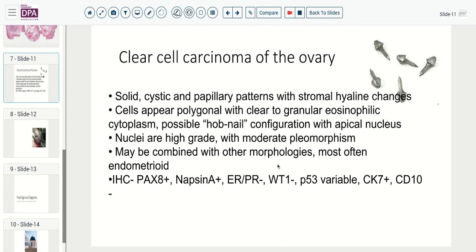Immunohistochemically, these are Pax8-positive cells, and very helpfully, they are Napsin-A-positive. No other ovarian tumors mark with this Napsin-A marker. Usually they are hormone receptor negative, WT1 receptor negative, and P53 expression can be variable — most are not mutated, but some occasionally will show that. As important for the differential, CD10 is negative, to make sure we aren't dealing with a clear cell neoplasm arising in the kidney.